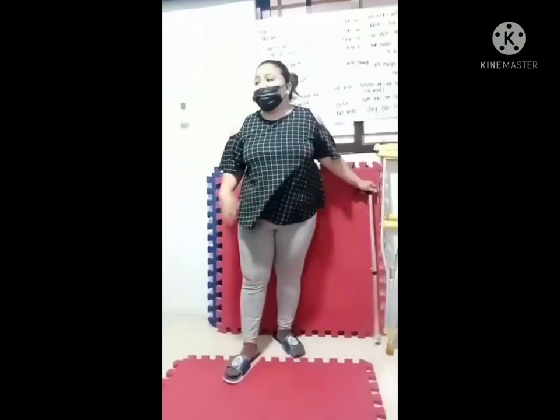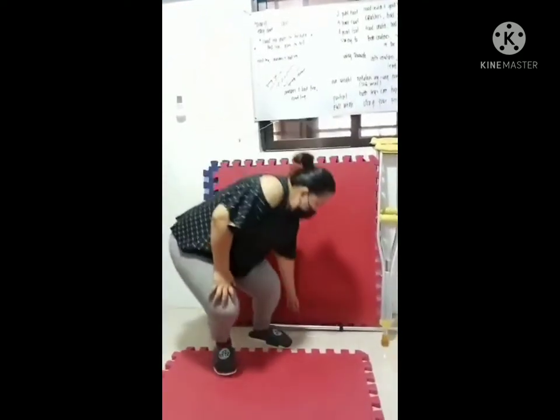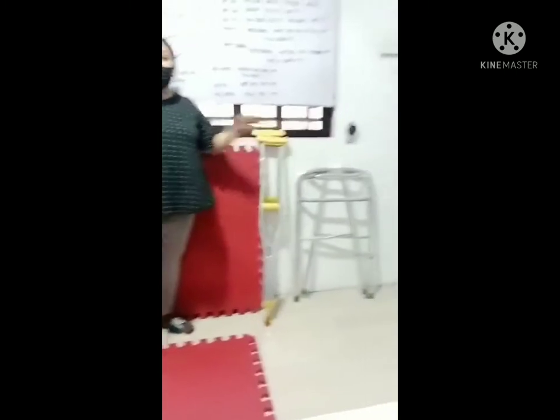This is Hazel and I am now demonstrating the proper use of an assistive device. We have a cane, crutches, and the walker.